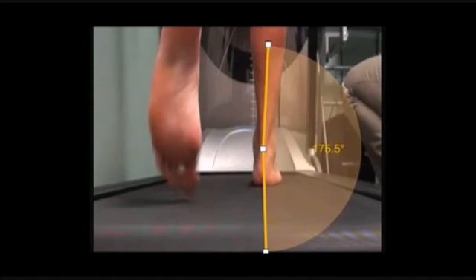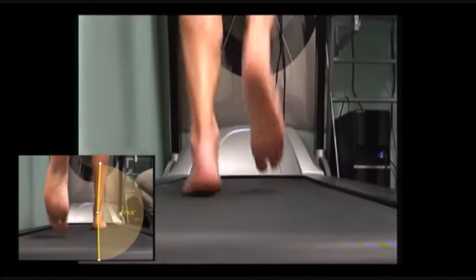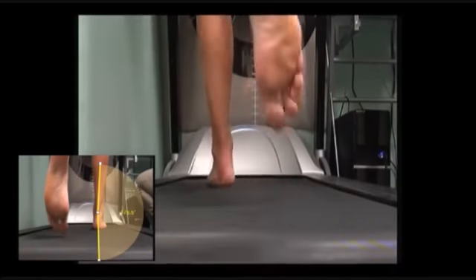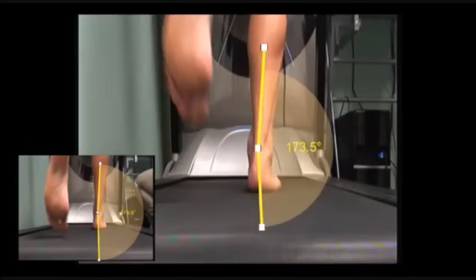You can see that when our customer is weight bearing on his right limb, his foot is 4.5 degrees pronated, where 4 degrees is the acceptable level of pronation. When running, it's difficult to see anything at full speed, but when we slow this down you can see that the amount of pronation has increased on the right hand side to 6.5 degrees.